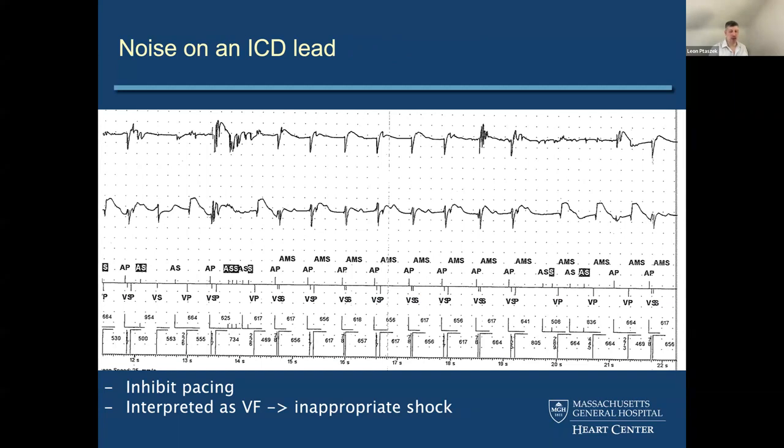device. And here, just to orient everybody in the audience, we're seeing signals, a surface signal, as well as an intracardiac signal. And again, the surface signal here is not one that truly comes from the surface, but an extrapolated surface signal generated by the data acquired from the intracardiac pacing leads. And then below it, you see the events, right?